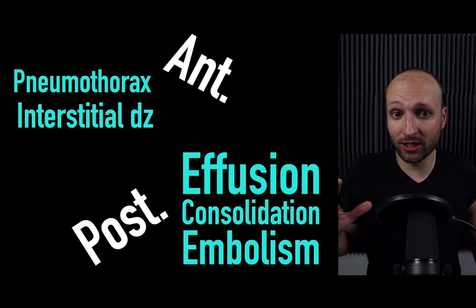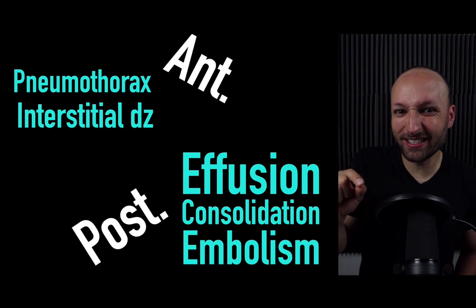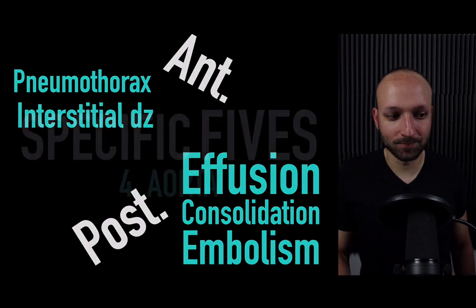And this is ultrasound in general: I'm usually asking myself a specific question. Does this patient have a pleural effusion? Does this patient have B-lines? And then I'm looking for that thing specifically.